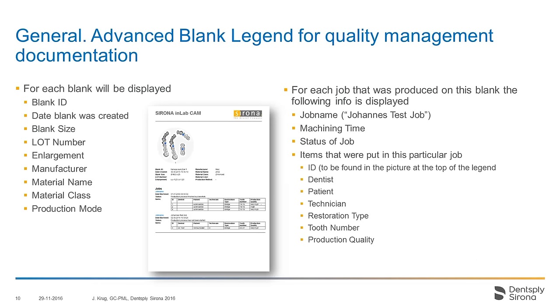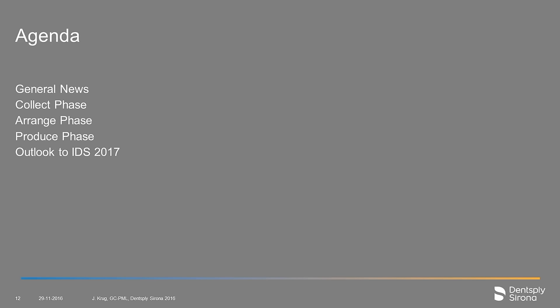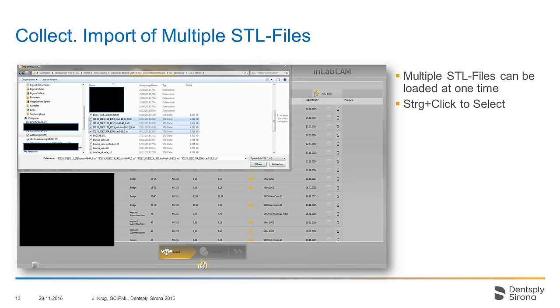The legend has improved a little bit. Now all restorations are shown in their particular jobs, so not only is a list of all milled restorations shown in the legend — there is also information available about which job a certain restoration was milled in, as well as information about the dentist, the patient, and all other necessary details. The legend can be opened either directly in the start screen or in the produce phase, so if you just want to take a look at the legend you can click directly in the start screen without opening a puck.